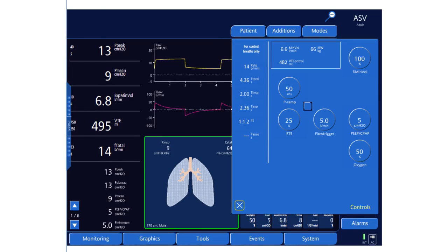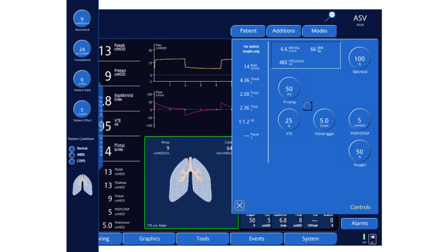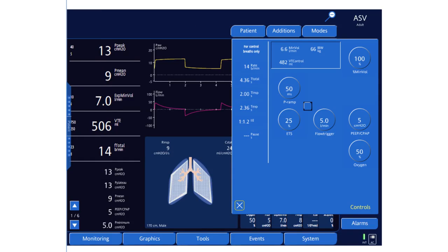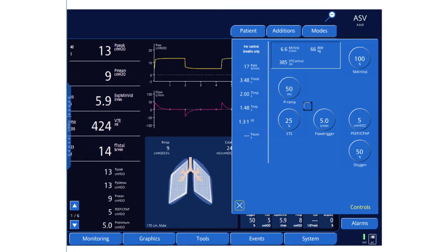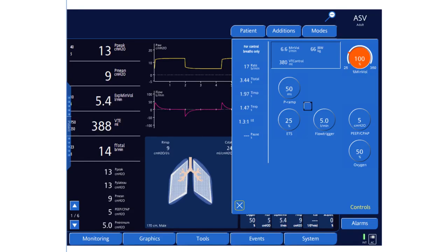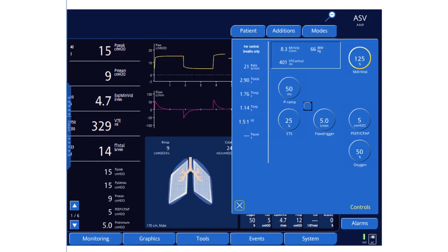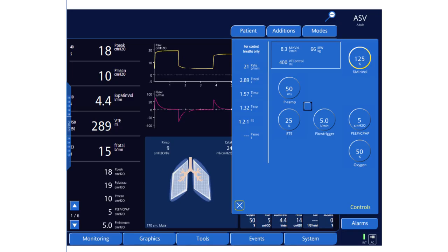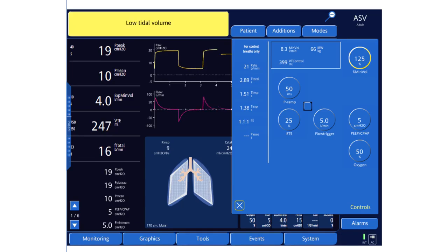In the Controls section, you need to decide what minute ventilation is adequate for that patient. Our patient here has ARDS with sepsis, so you need to give him a higher minute ventilation than the normal — at 100 ml per kg — so let's set it at 125%. In patients with asthma, you may decide to give lower than 100%, at 90%, to decrease the risk of dynamic hyperinflation.